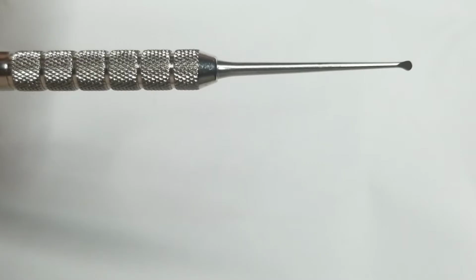After which you're going to need this instrument that I was talking to you guys about earlier. This is a Cleoid Discoid. It has a triangular end and a round end. It's very small. I'm going to take a picture of it and insert it as well. You're going to use this to carve your amalgam. Once again, it doesn't make sense right now because you don't understand, but you're going to need it.